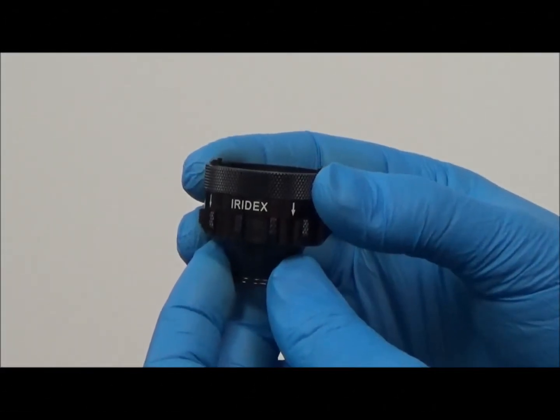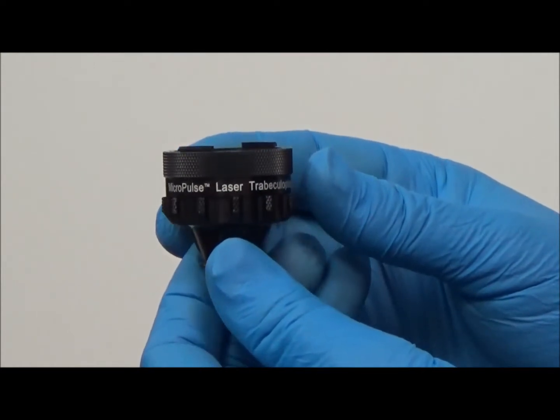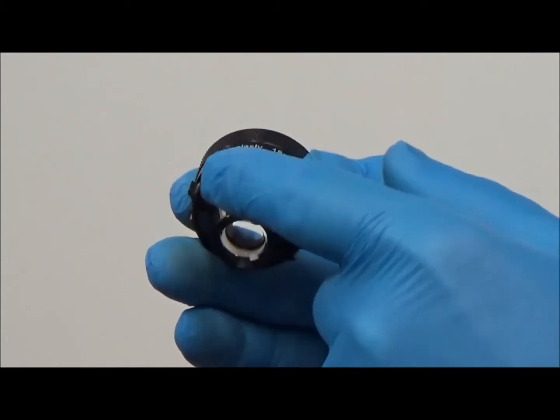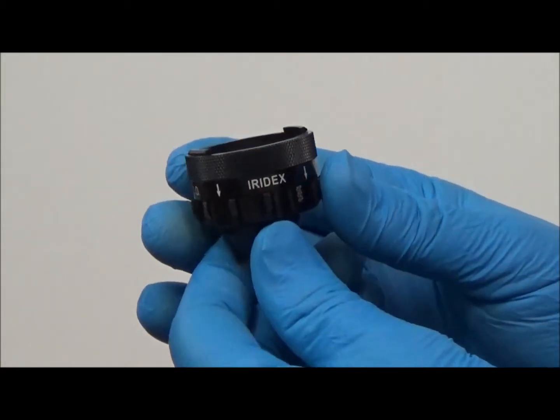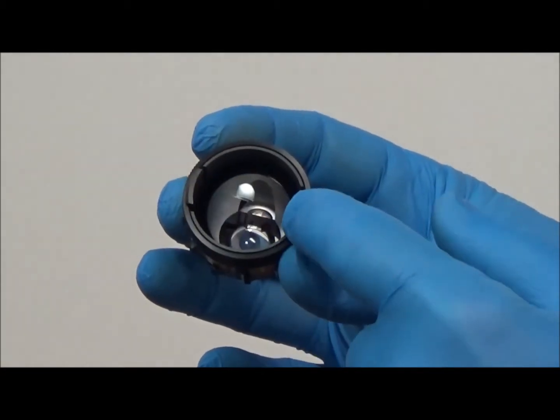The micropulse laser trabecular plasty gonioscopy lens consists of two main parts: the anterior knurled rim and the lens with its extended knurled tabs. Note the anterior rim is easily removed for cleaning. To disassemble, press the opposing tabs together and slide off the anterior knurled rim.